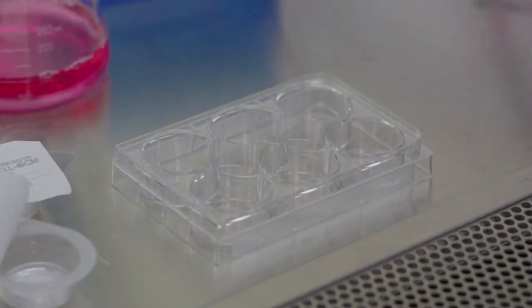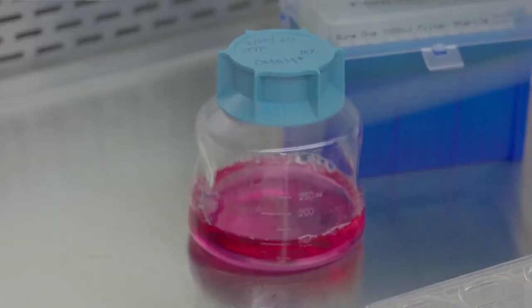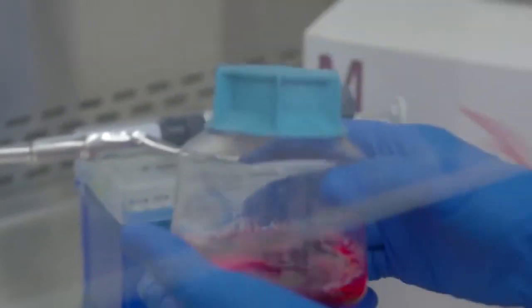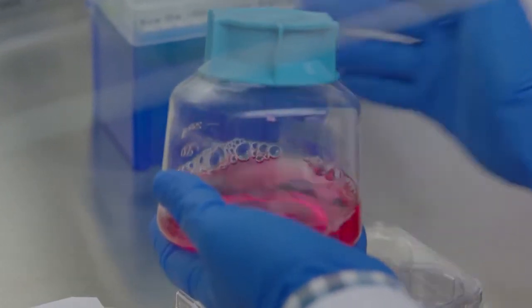First, let's prepare a 6-well plate containing about 1 milliliter of media. It is recommended to use warm media, as cold media can hinder the wetting processes. Now, the media does not need to be exactly at 37 degrees Celsius, but it is warm to touch.